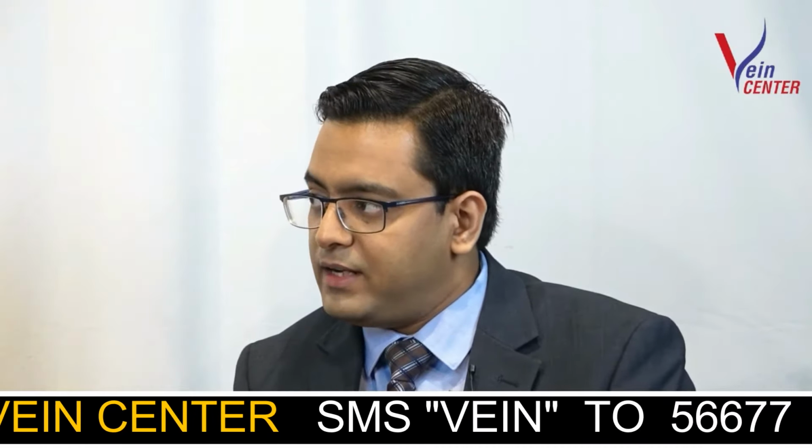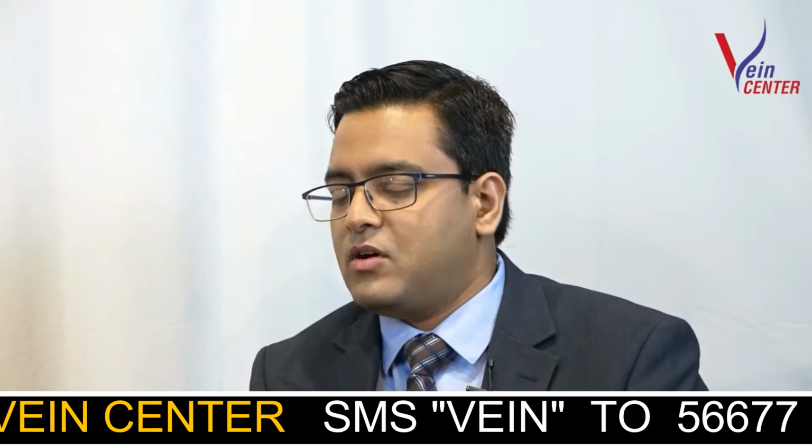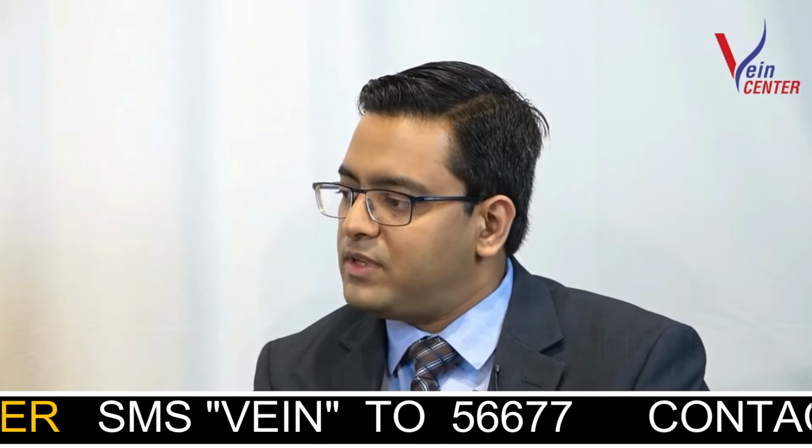Other than the clinical findings or the visible findings, the gold standard for diagnosing varicose veins is an ultrasound examination. This is a sonography of the legs, also called a color Doppler ultrasound, in which we see the size of the veins, the functioning of the valves of the veins, and the arrangement or the mapping of the veins, and this is the current best way worldwide to diagnose varicose veins. Now, at all our centers we have ultrasound-enabled OPDs, where all our doctors do the ultrasound at the time of the consultation. Thus, we have a foolproof diagnosis of varicose veins, which can be treated according to the diagnosis.